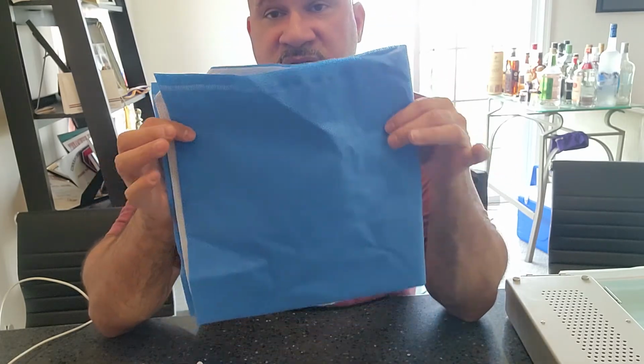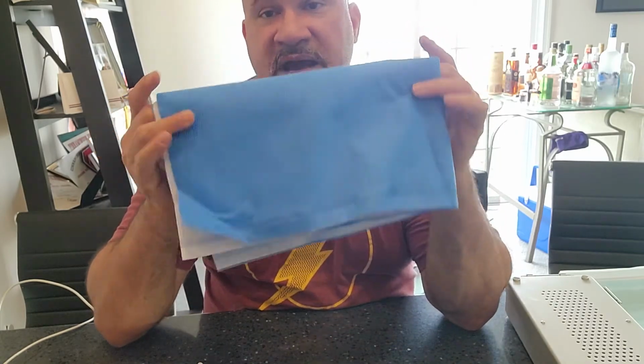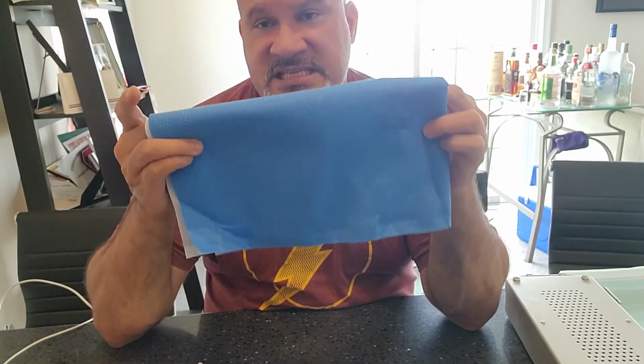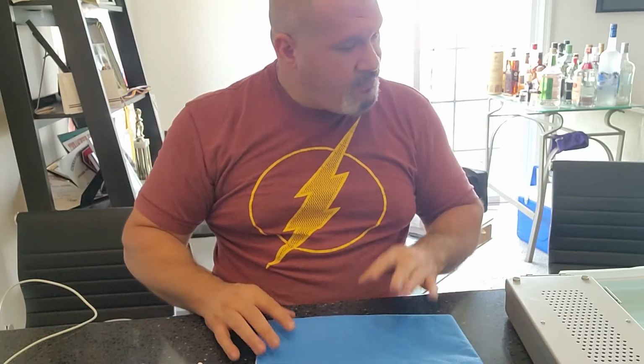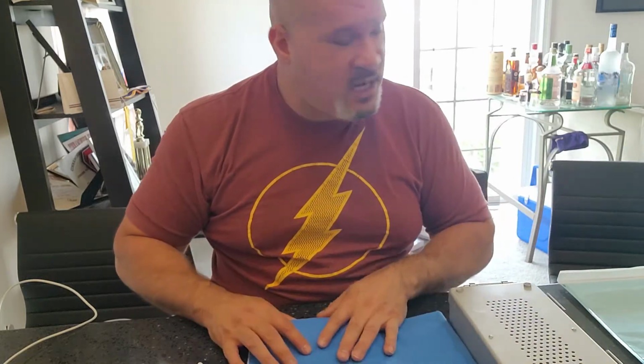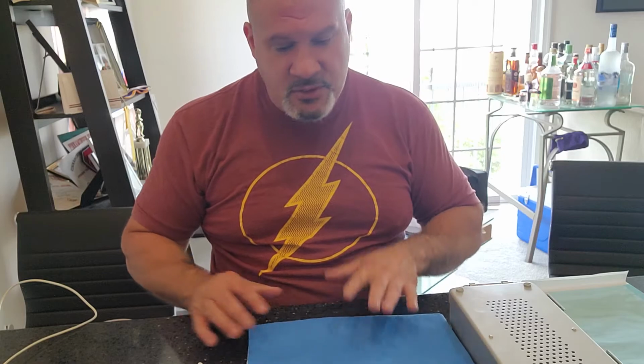So dry time is 15 minutes for the medical device, 30 minutes for the packaging system, 30 minutes is what you use. If the medical device has a dry time requirement of 40 minutes, then you have to run it at 40 minutes. You have to exceed the packaging system's dry time. All right, guys, I hope that explained more to you about packaging systems and determining which you can use and what you can't use.